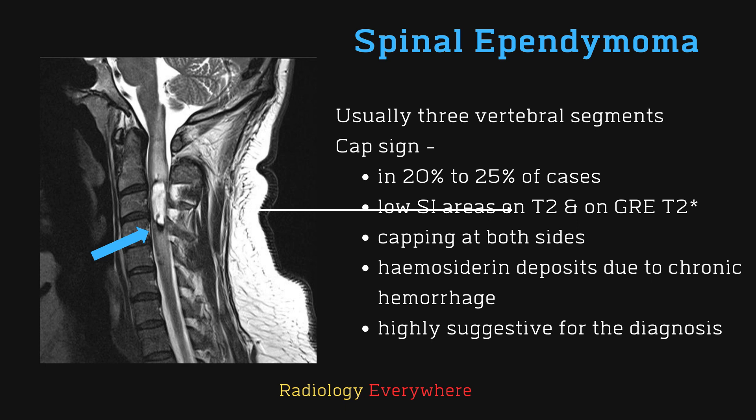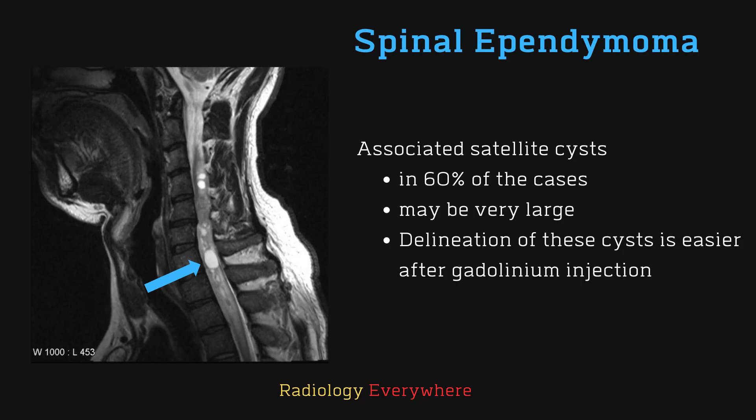We can see the cap sign in 20 to 25% of cases. This corresponds to low signal intensity areas on T2 and gradient echo T2-star images, and we can see the cap at both sides of the tumor margins. These caps are hemosiderin deposits due to chronic hemorrhage of the tumor. If you can see the cap sign, it is highly suggestive of a diagnosis of ependymoma.